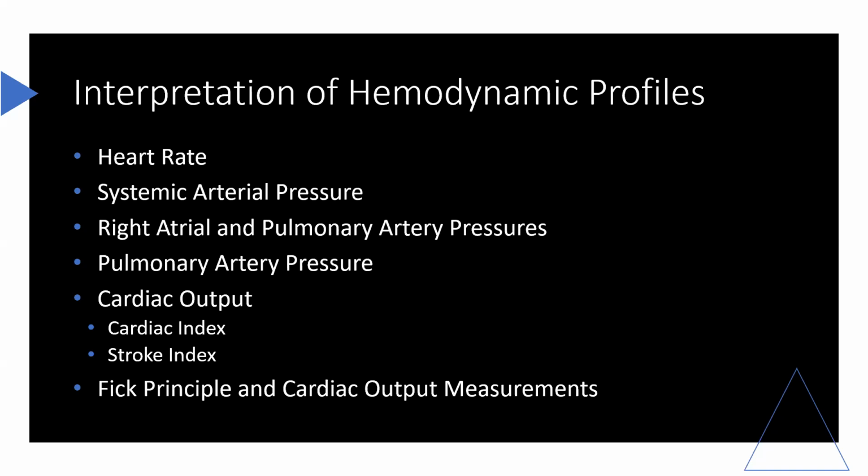The right atrial pressures and left atrial pressures are reported as mean values rather than as systolic and diastolic values. The RAP, more specifically CVP, normally ranges from 2 to 6 millimeters of mercury. The left atrial pressure, as estimated from the pulmonary artery occlusion pressure, ranges from 5 to 12 millimeters of mercury. CVP and PAOP measurements commonly are used to determine overall fluid balance. A low CVP or PAOP suggests hypovolemia, whereas elevation of either of these pressures indicates hypervolemia or ventricular failure.